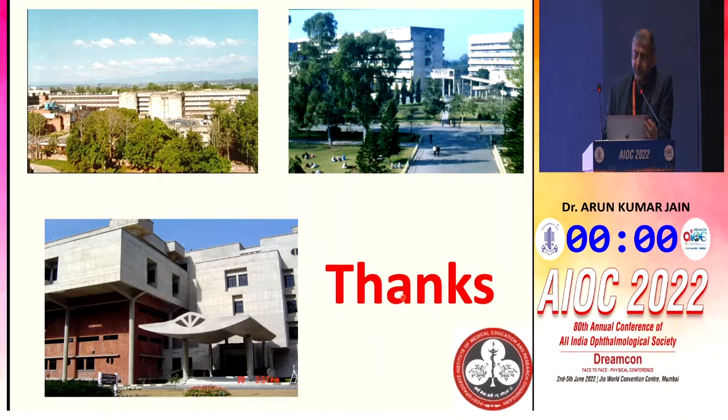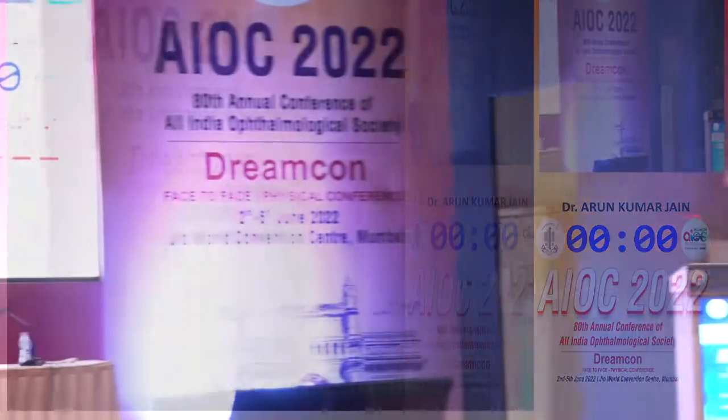Well, thank you, sir, for an excellent talk on Pentacam and what it can do for us. Any questions from the audience? We can take one question from the audience, or any comments from the panel.